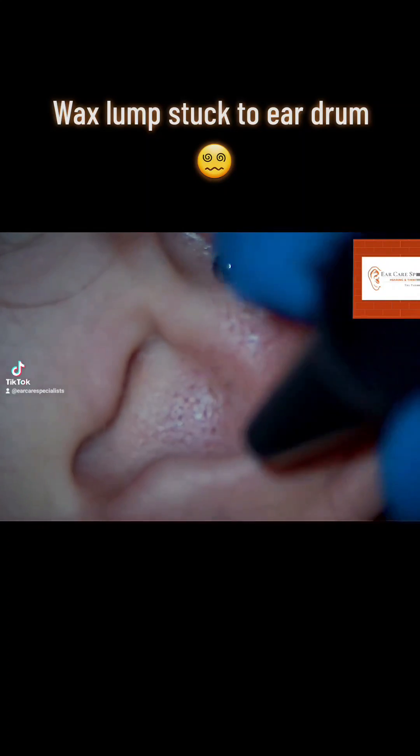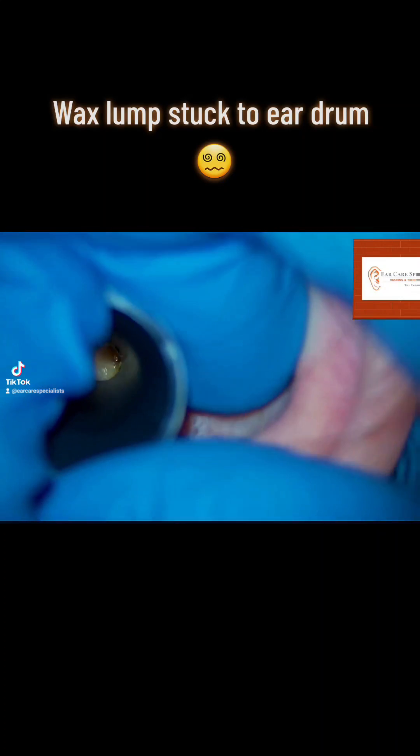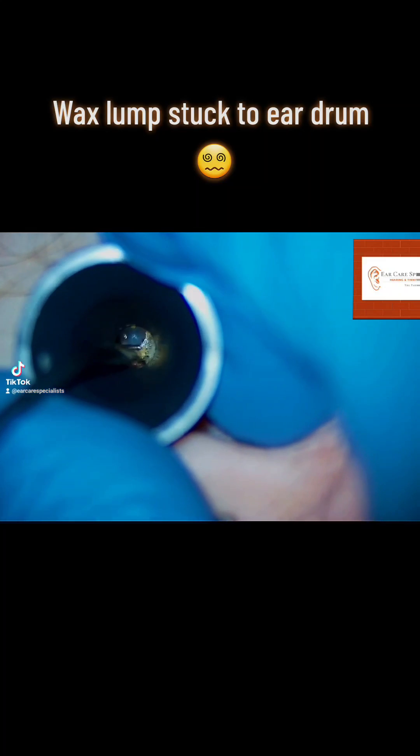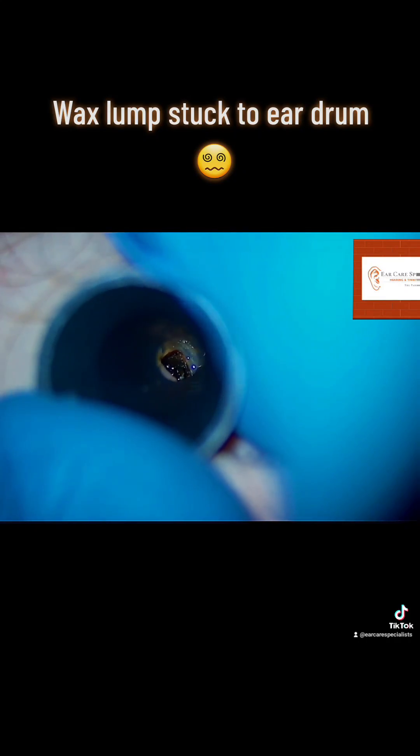We just remove these carefully. We then go back in and take a look a bit deeper down the ear, remove a little bit more skin, when I notice a lump of wax stuck directly onto their eardrum. Now because they've been using some oil drops you can see it's nicely glistening there.